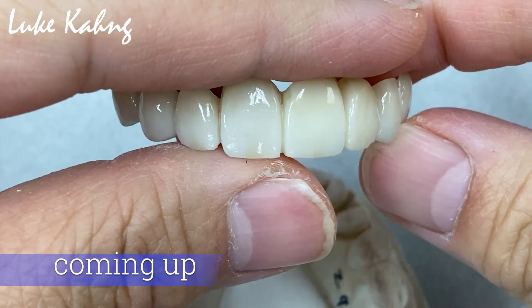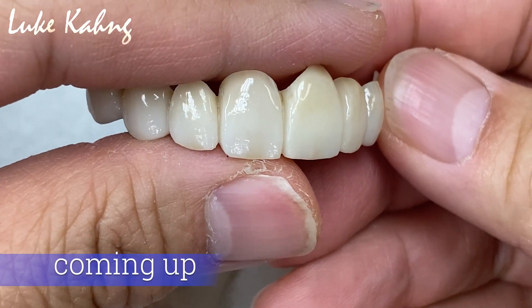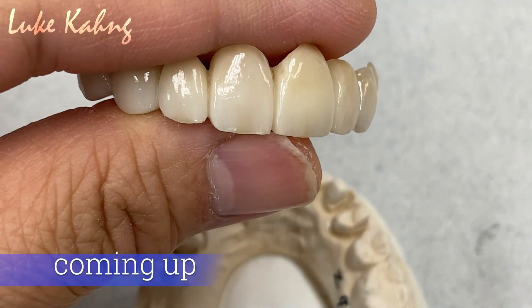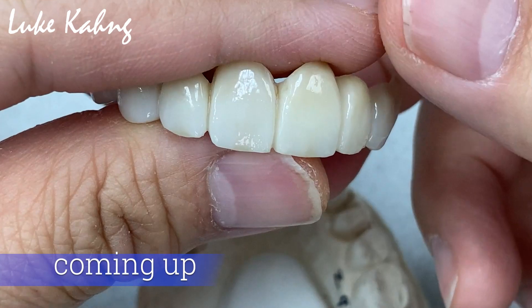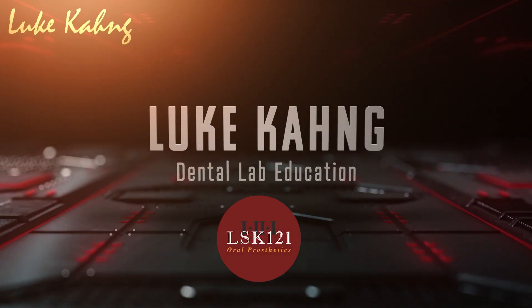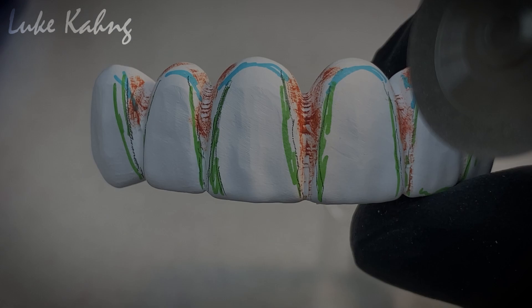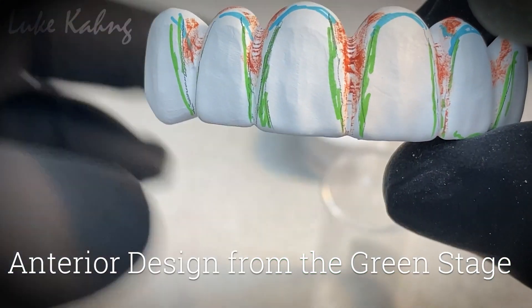Okay, so you saw all those processes from before. Zirconia centering with the green stage — we ground six-unit zirconia cases.